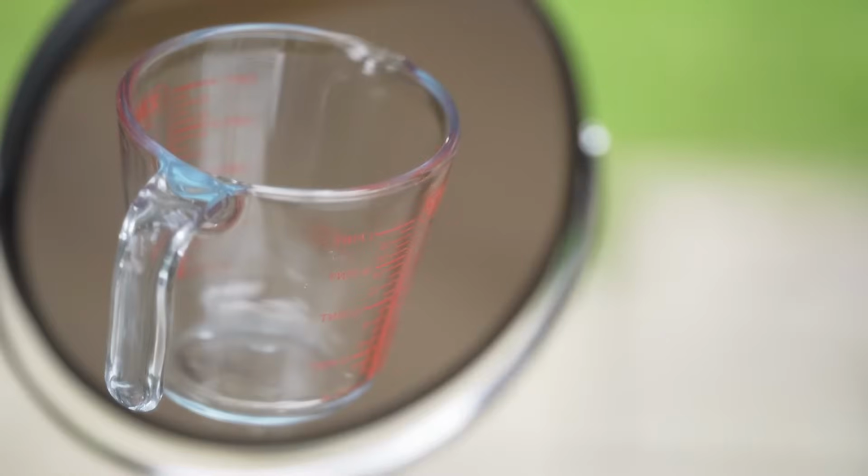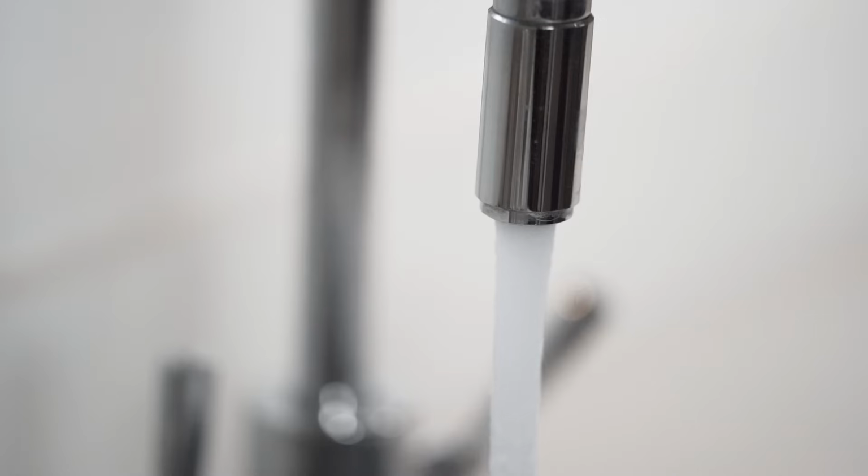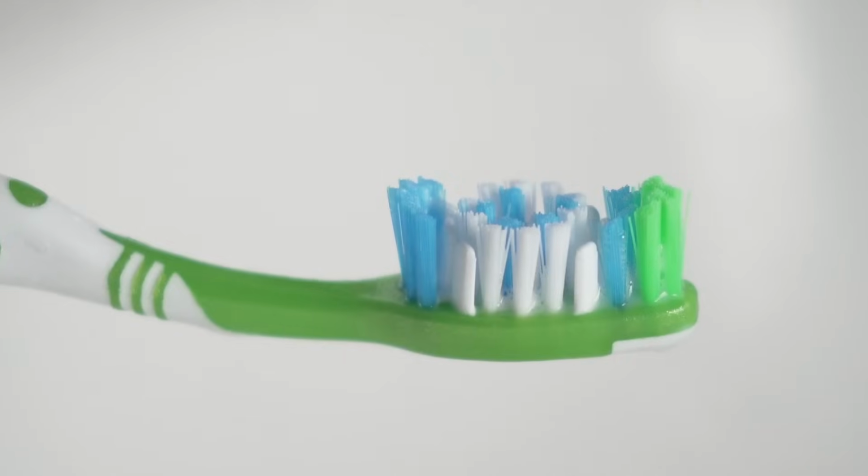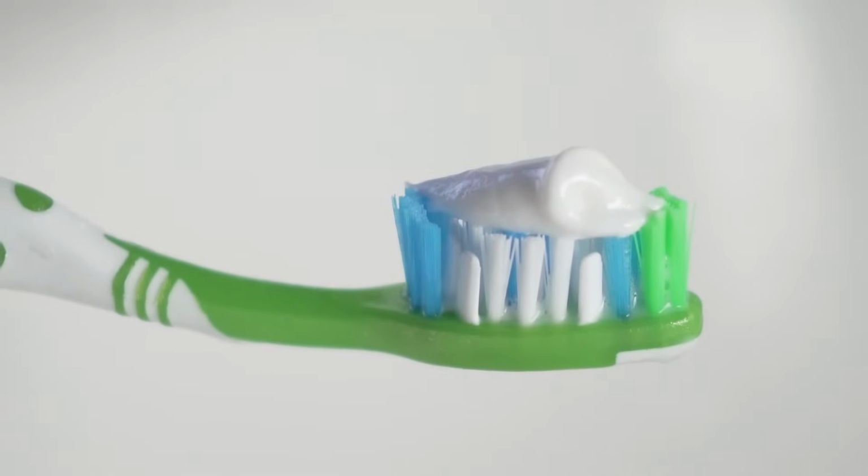Before you begin, you'll need a mirror, a measuring bowl or a jug, access to a cold water tap, a kettle and a timer. Make sure you clean your teeth before you start the fitting process.